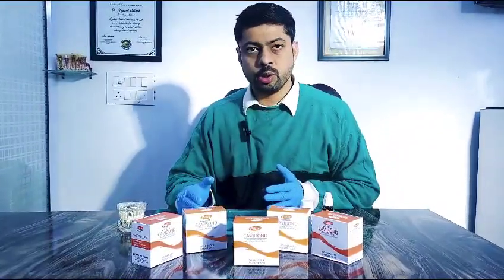Hi friends, welcome to another interesting video. This video is about Cavibond. It is polymer reinforced zinc oxide eugenol cement.